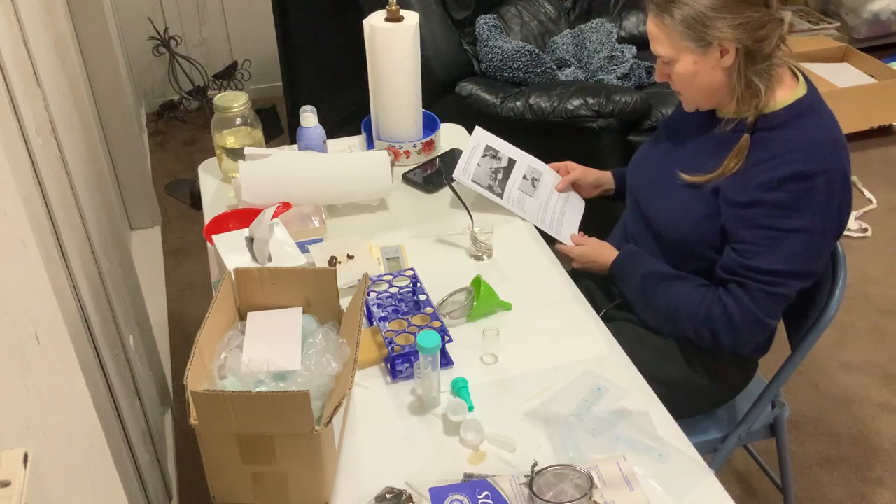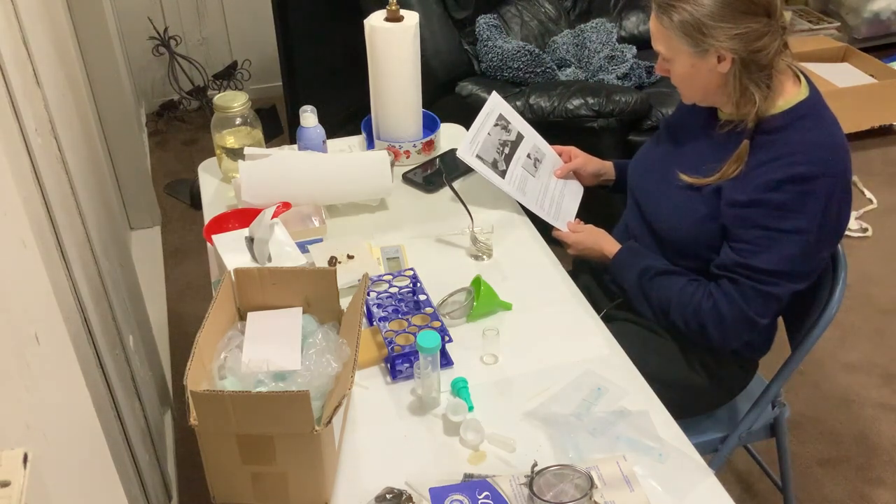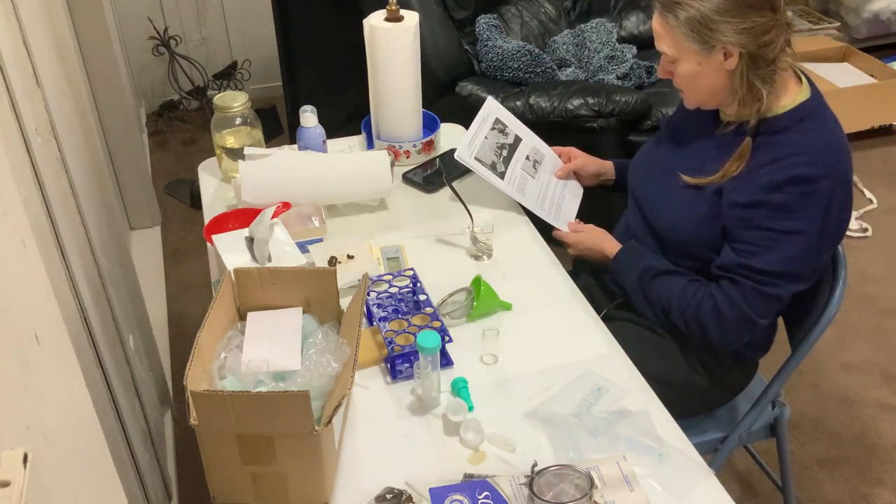I'm supposed to mix them up in there and then let it soak for approximately five minutes.